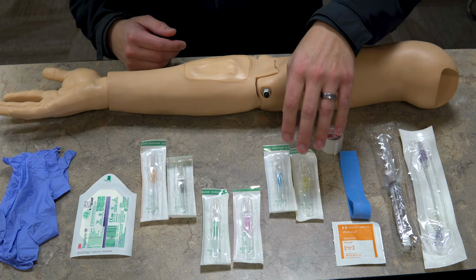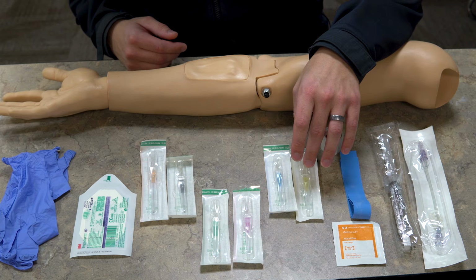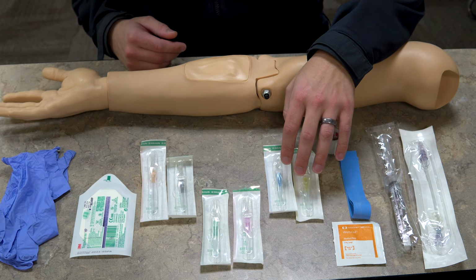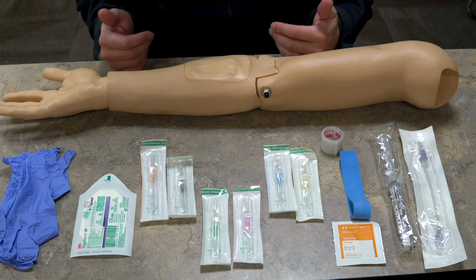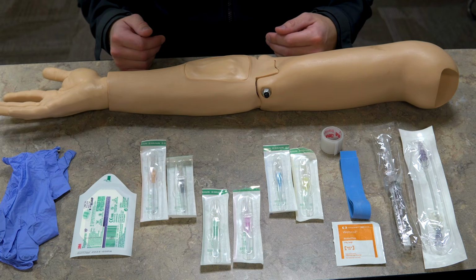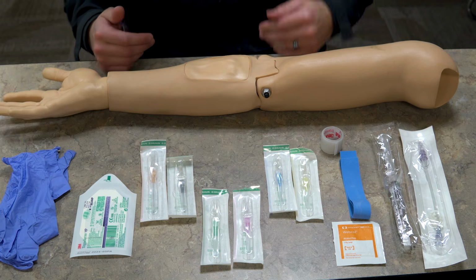Some medications, such as blood, can't be given in the 22 quite as well, or the 24, and these are pretty hard to push fluid through. And then when you start getting into the 14 gauge needles, those, in my opinion, are a little bit excessive for most everything we're doing. Not saying there isn't a use for them, but I don't use them primarily.